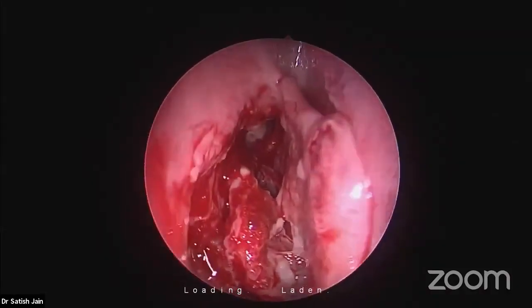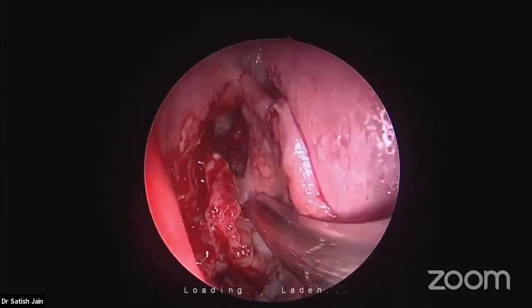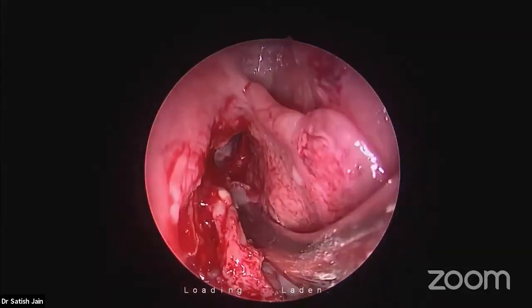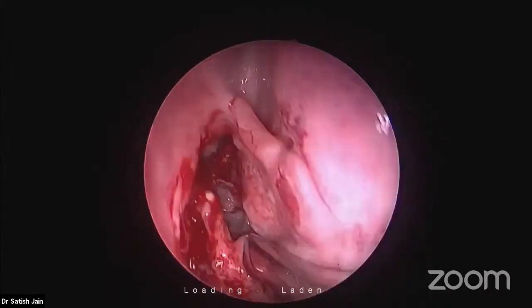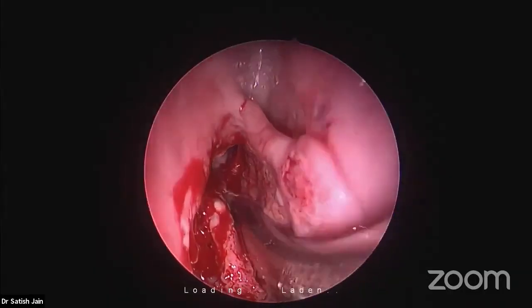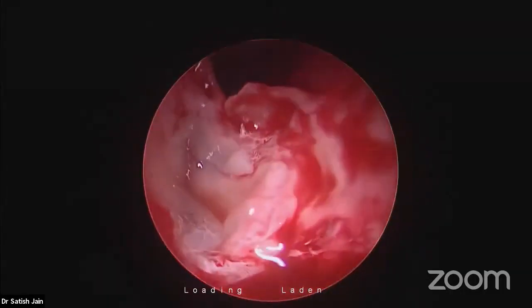Let me show you. Now, what Dr. Kranti is asking about is the suprabullar cell. When this bulla is not ascending to the skull base, that area is occupied by a cell. Can you see the artery behind? I just fractured the bulla to show how the bulla protects the artery. See the artery there.